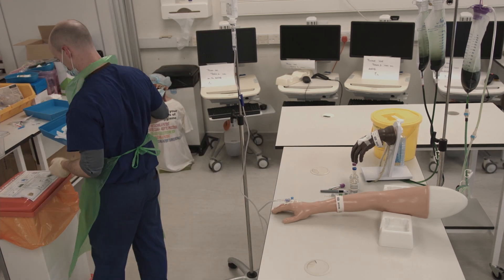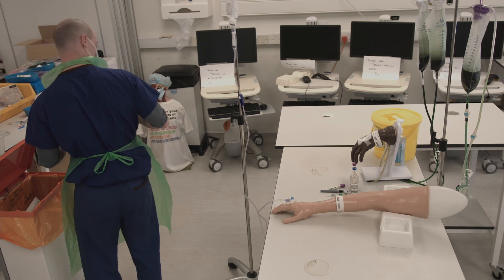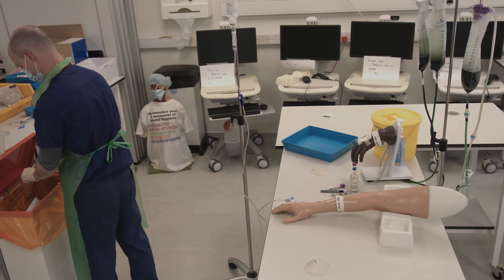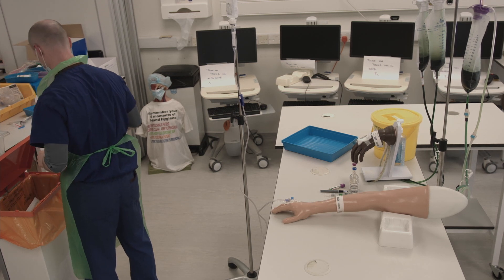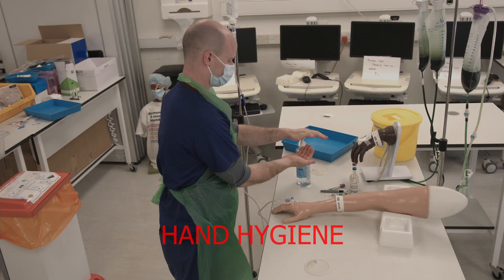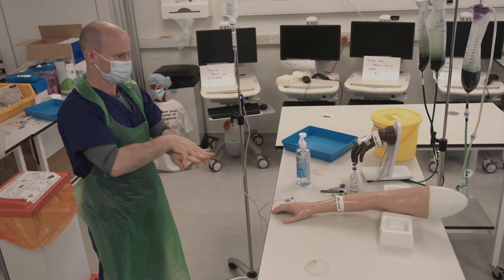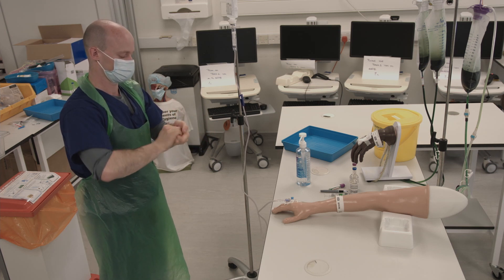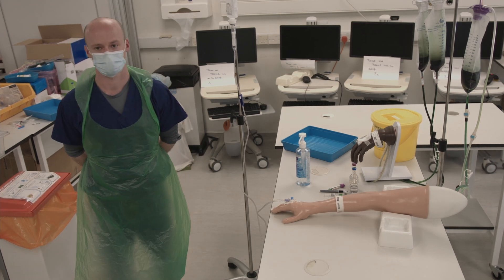Discard any waste. Then remove your gloves through the pinch pull method. Once again, clean your hands thoroughly. This is the end of the blood transfusion station.